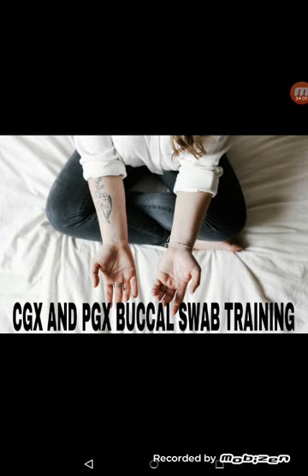So you will have 2 swabs with that patient's name and date of birth, and you will have 2 separate bags, 1 for PGX, 1 for CGX. Again, please make sure that if you're doing a PGX and a CGX on one patient, you do 2 different swabs.